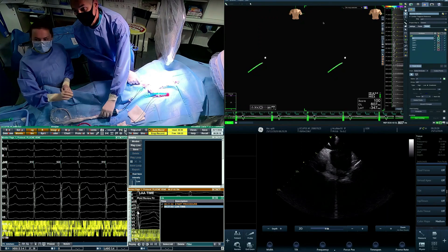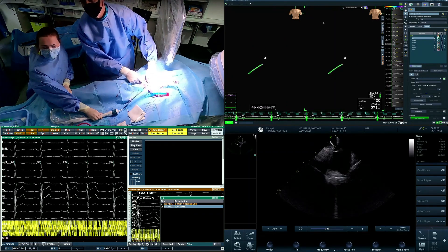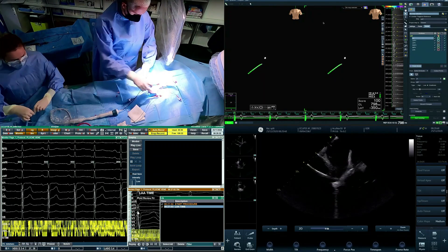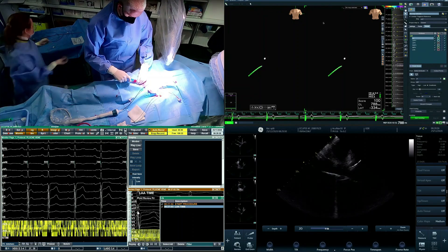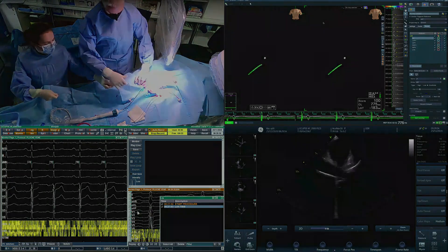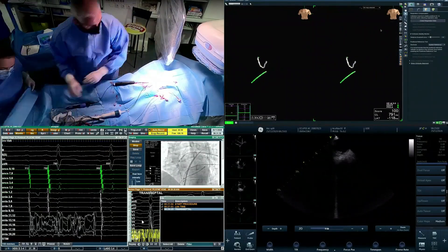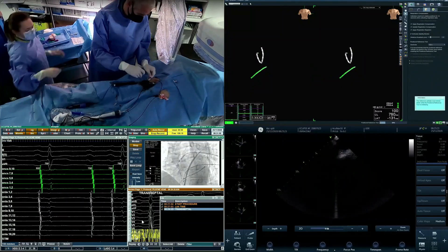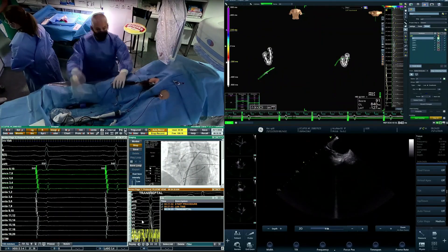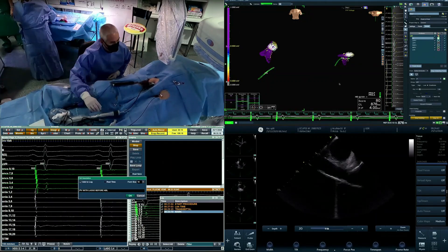You see here that we're doing transseptal under ICE. In the right lower corner you'll have the ICE image throughout the procedure. In the right upper corner you'll have a display from the mapping system, and in the left lower corner you'll have the recording system and also a fluoroscopic image. Once we obtain left atrial access — I'm talking about a regular case here.